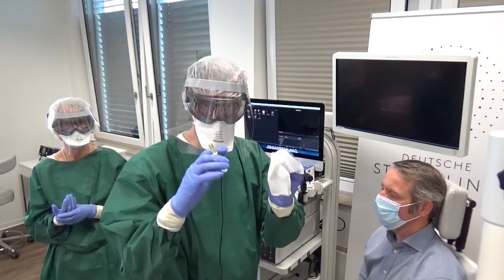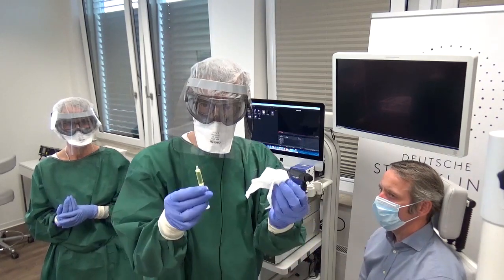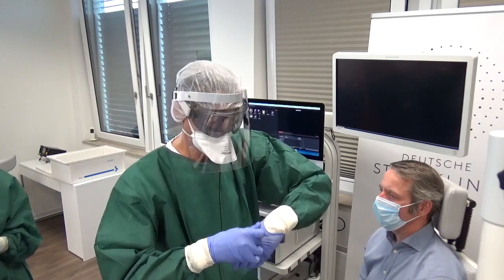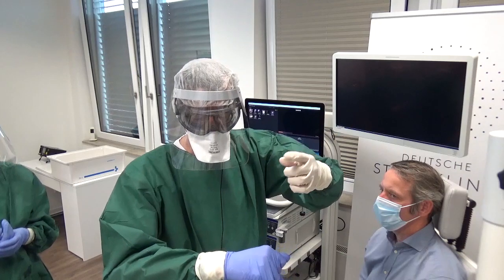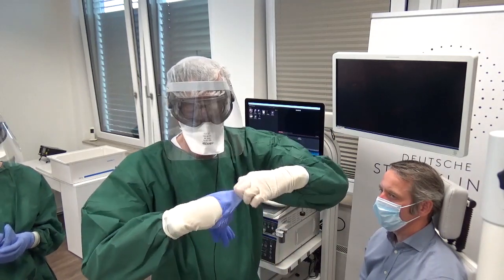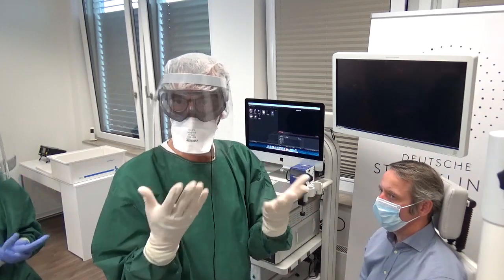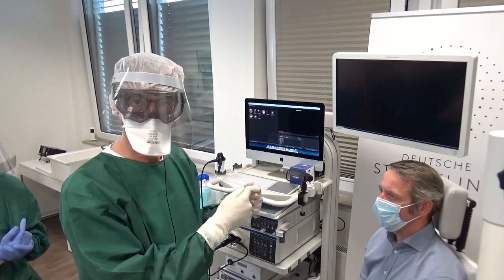Then I will throw this off — both hands are now contaminated, which means I get rid of both outer gloves. I take this glove off, clean, then take the other one off and throw it away without touching anything. Now my gloves are supposed to be clean. Now I take the endoscope from the assistant.